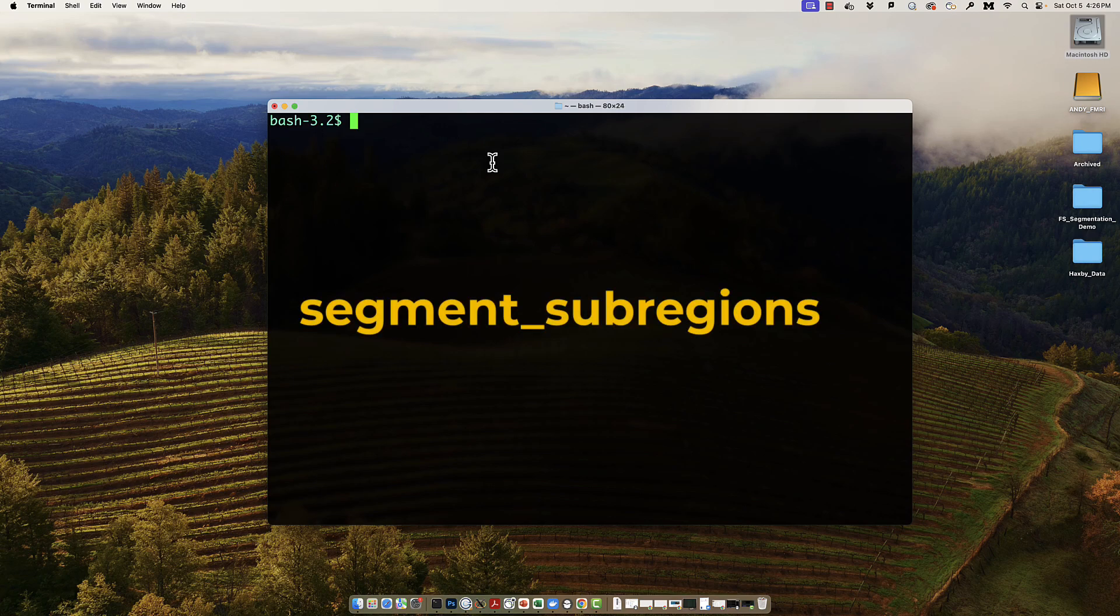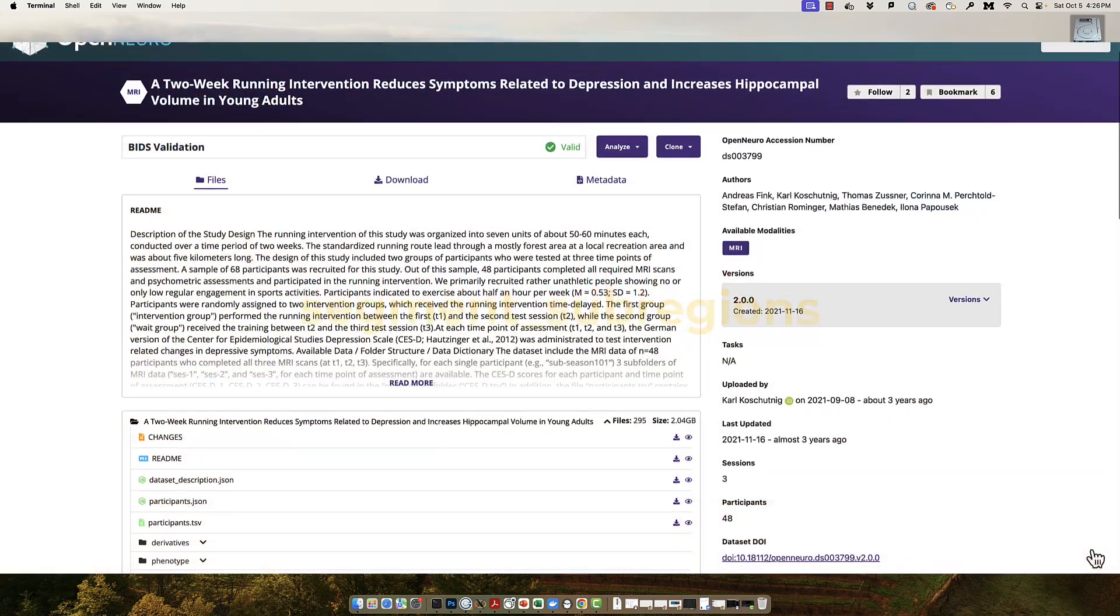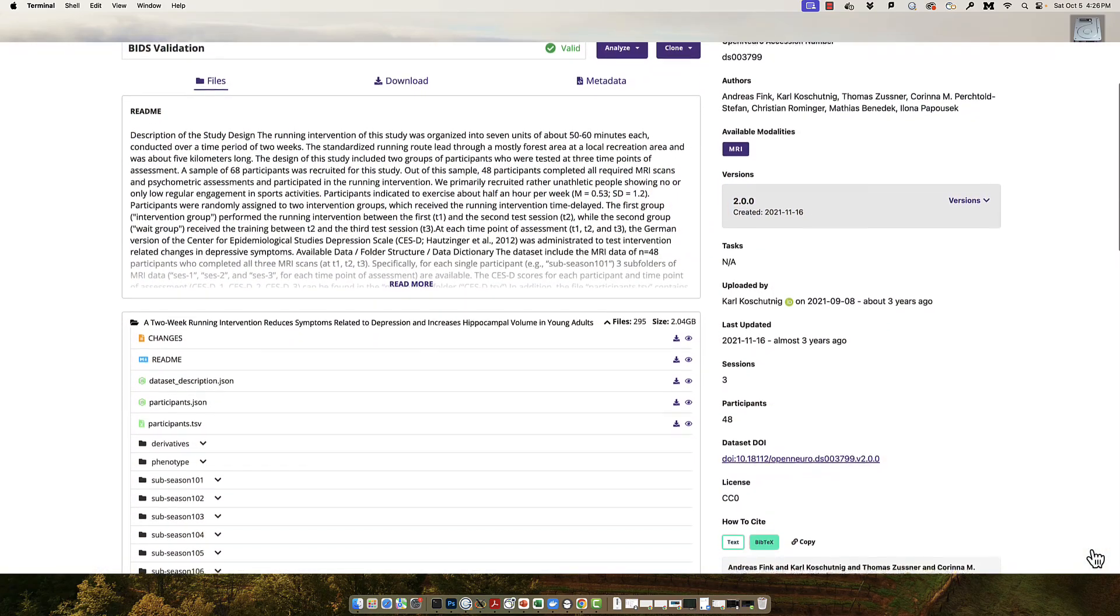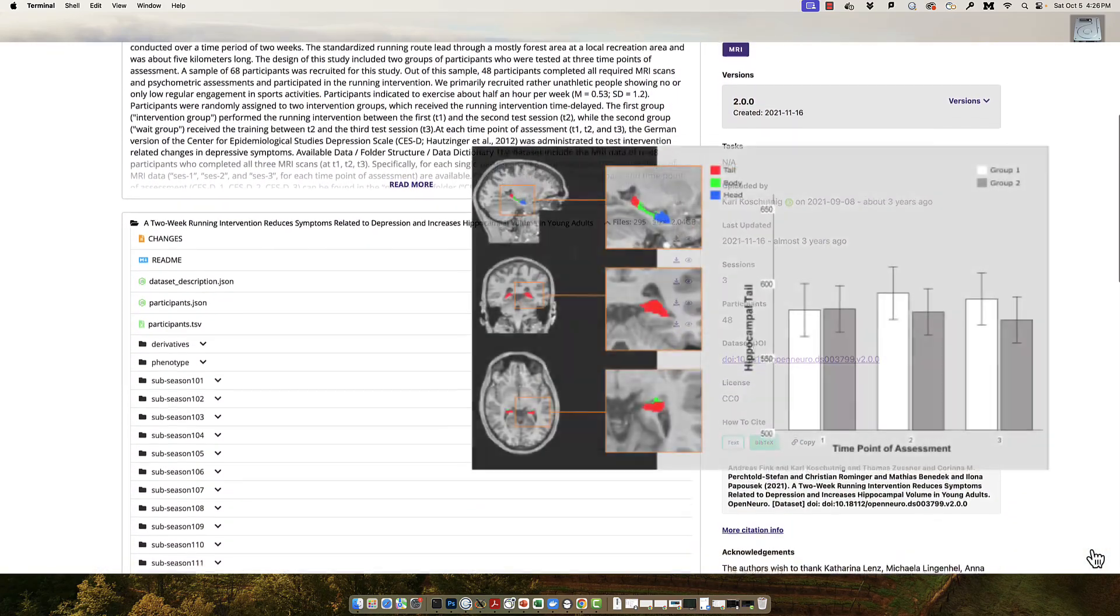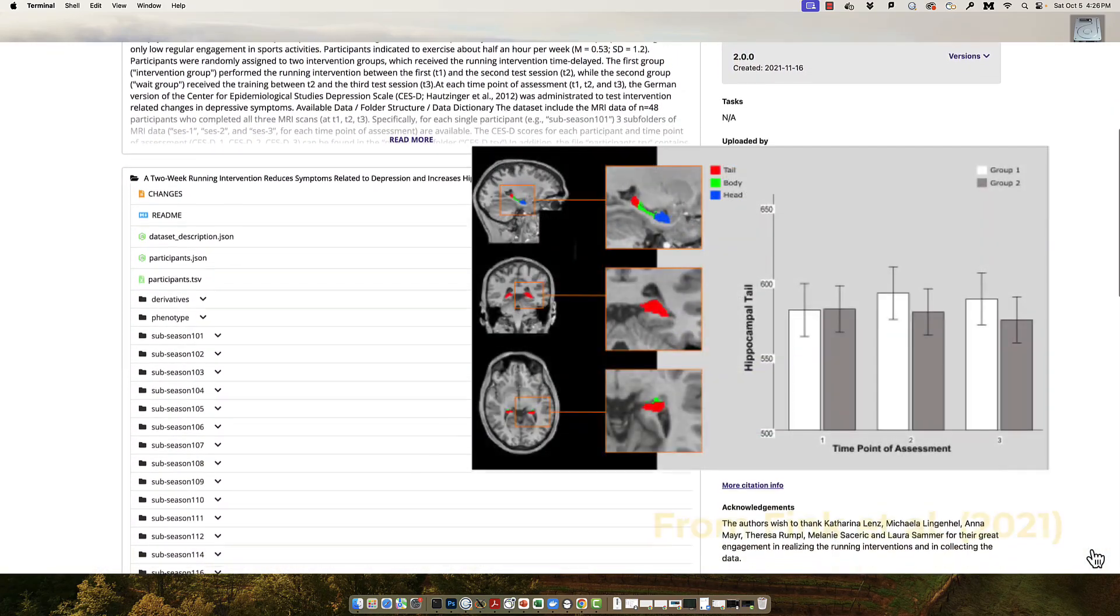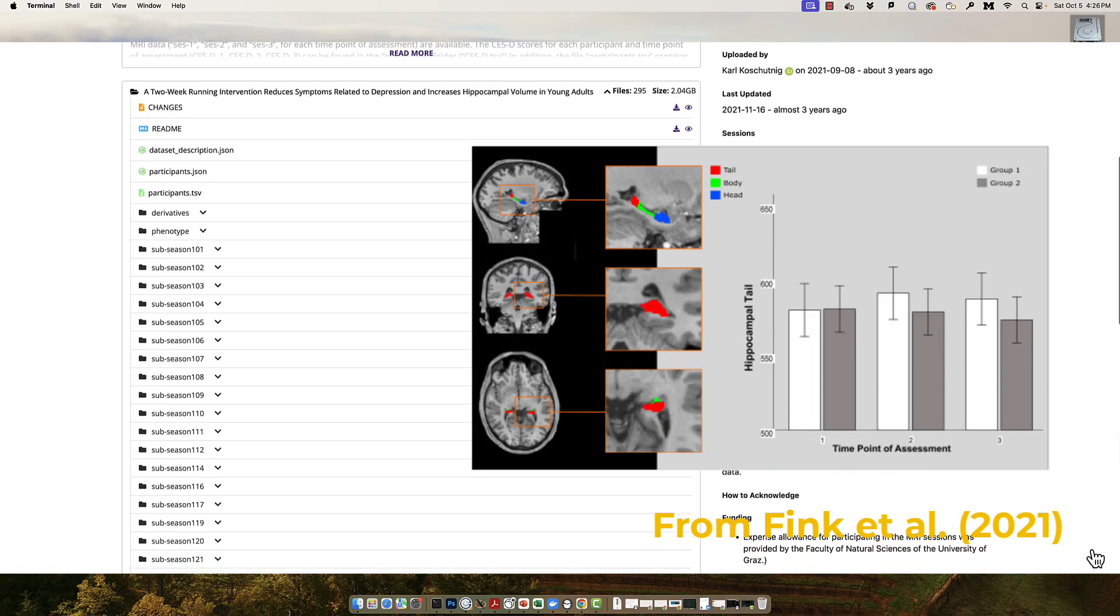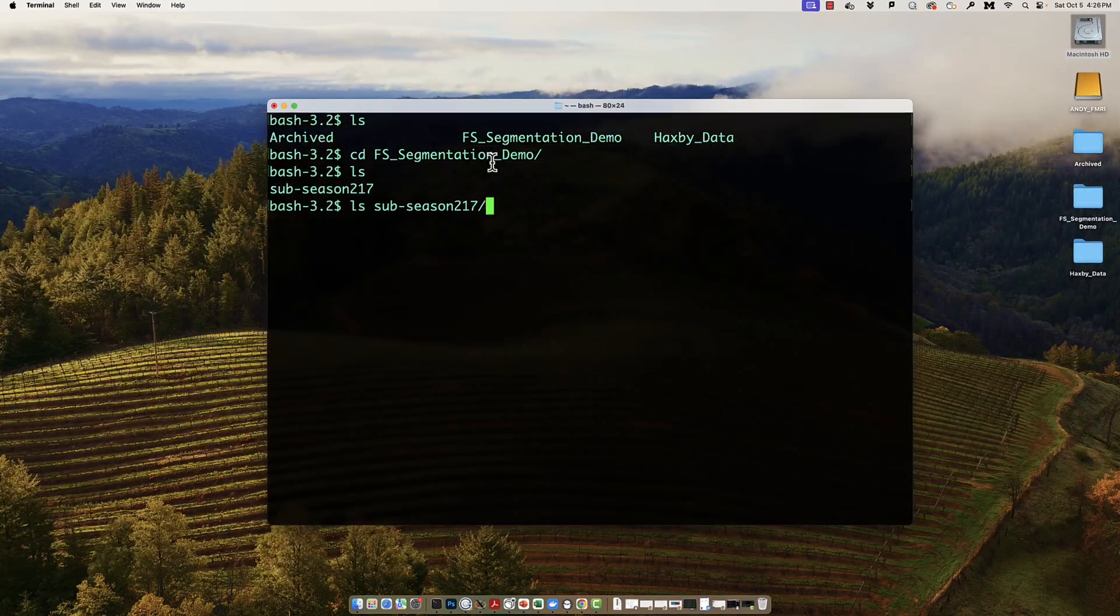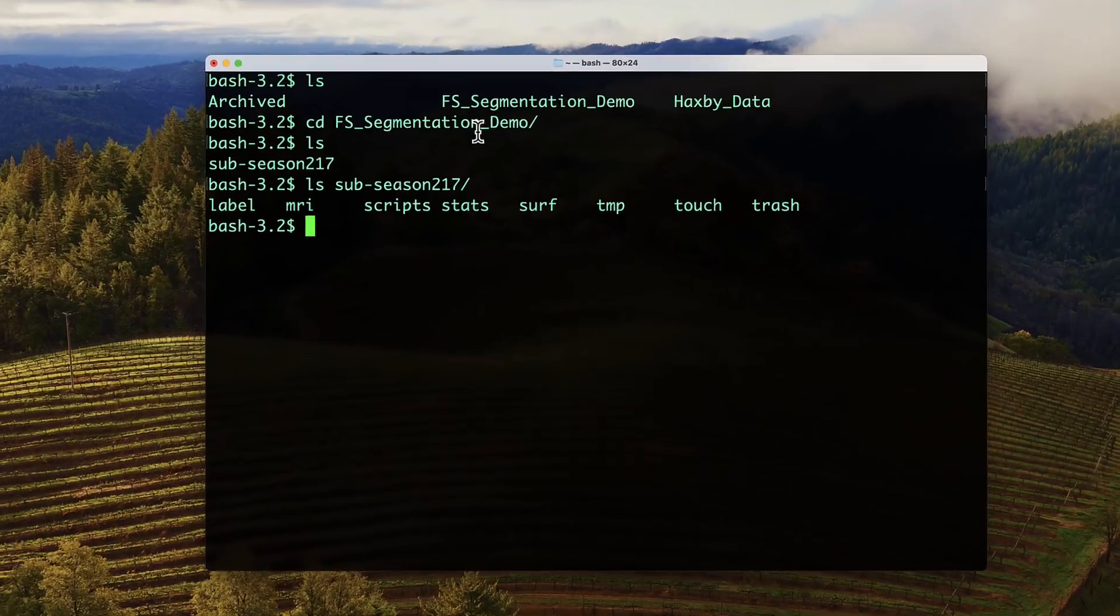I have a subject downloaded from the Fink et al. 2021 study, which looked at hippocampal volume changes as a result of a running exercise intervention. As you can see, these data have already been run through ReconAll.